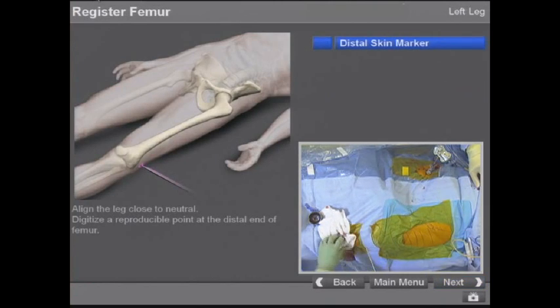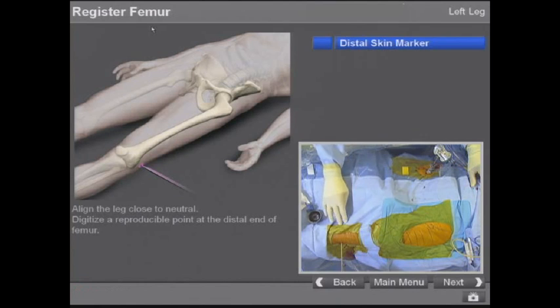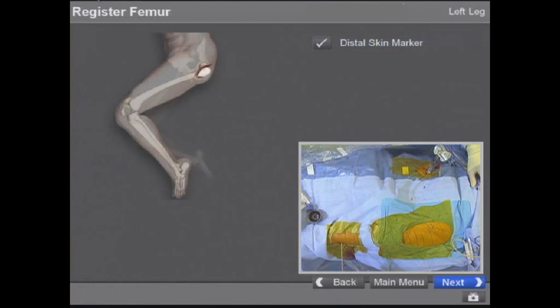For the distal marker, we put our gun into the hole — I can find it real well, I'm in the hole — and that gives me a very accurate distal marker for leg length.